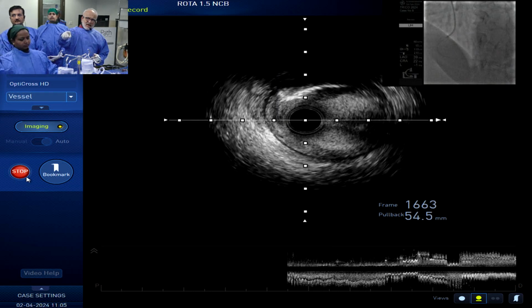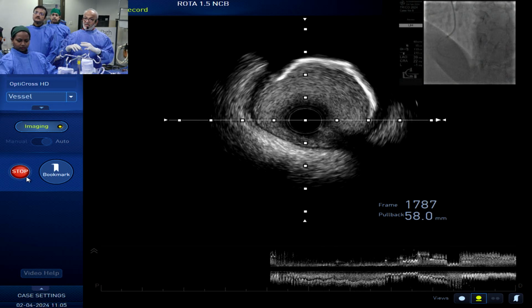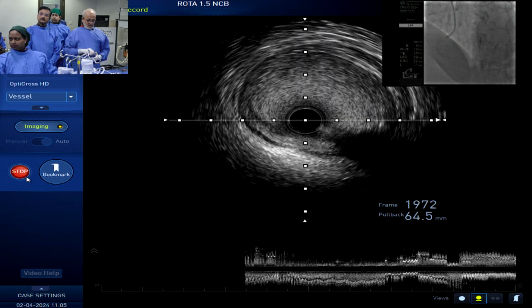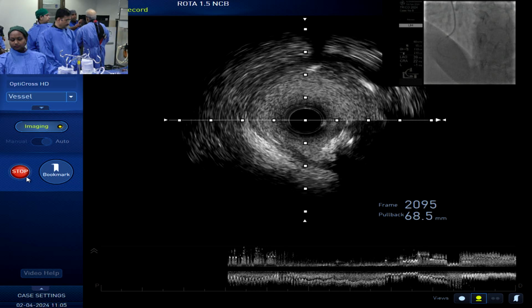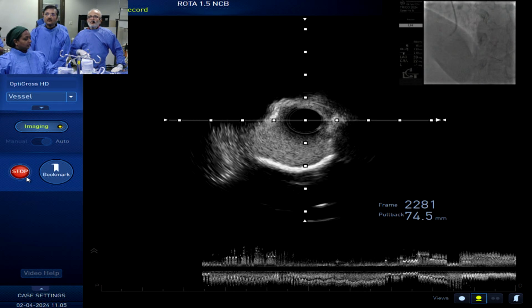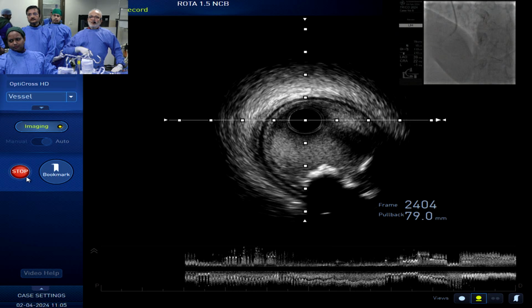How do you decide the thickness of the calcium and the calcium spread looking at the IVUS vis-a-vis OCT? Yeah, right. IVUS, generally speaking, has lots of shadow from the calcium. Correctly speaking, it might be very difficult to measure correctly.